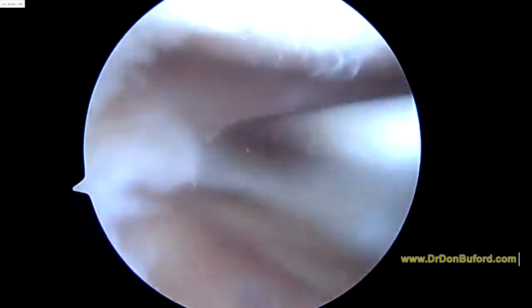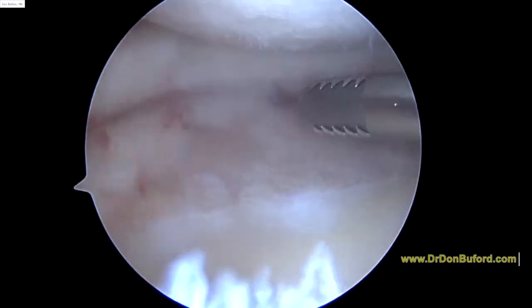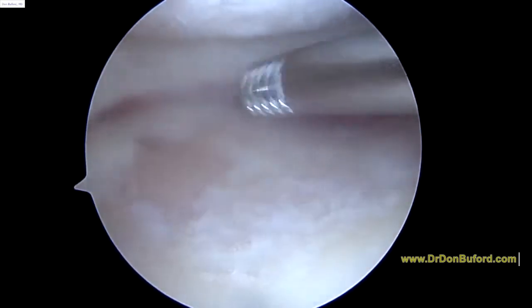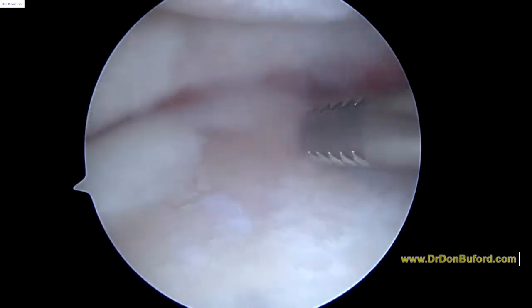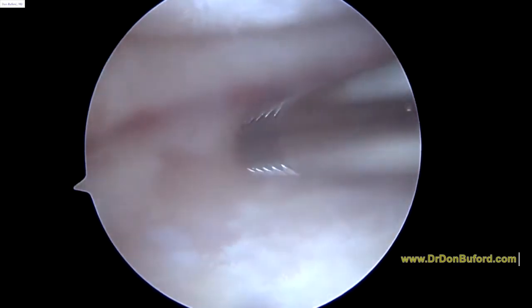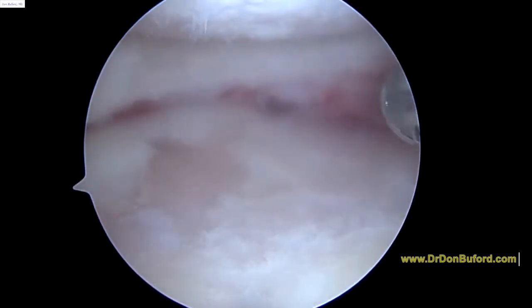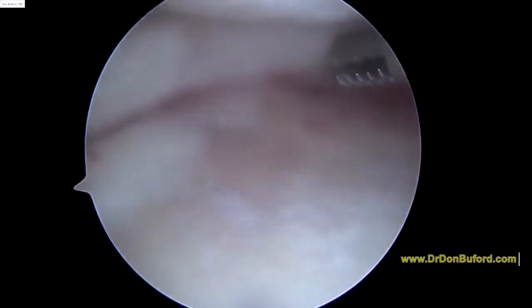Certainly this meniscus has been bothering you quite a bit. I'm just going to trim it back a little bit more because there's nothing that these avascular frayed edges can do but hurt. So we've cleaned up this compartment as best we can. What you really need is to try a stem cell injection and see if we can get you better for two or three years with that, because it's just this one compartment so far. The medial side looks good. And even if you had to do a subchondroplasty, I think that may buy you the longest amount of time and minimize the symptoms of your arthritic disease here in this lateral compartment. We talked about it in the office — I just want to mention that today because you're a big candidate. We've had a lot of people come to the office that reported a lot of pain relief by doing that.